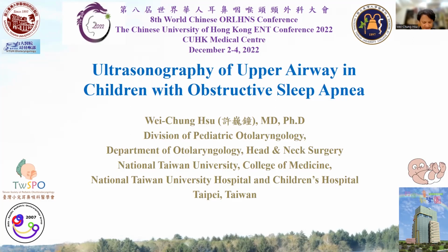Today, my topic is ultrasonography of upper airway in children with obstructive sleep apnea. There is no conflict of interest, no financial disclosure in my presentation.